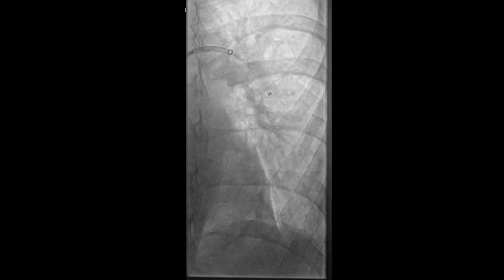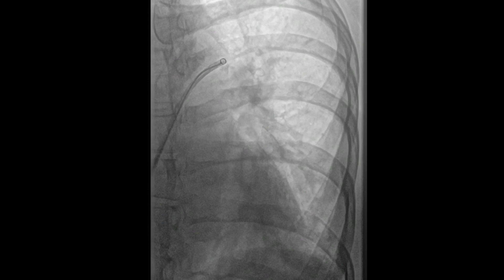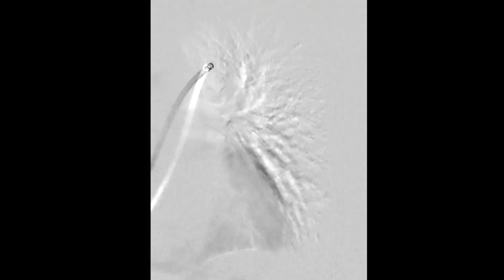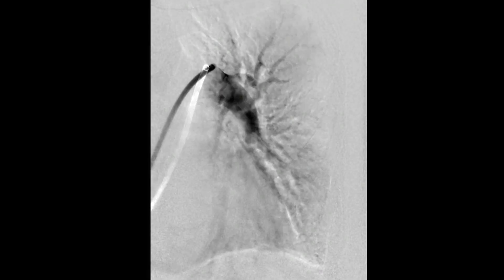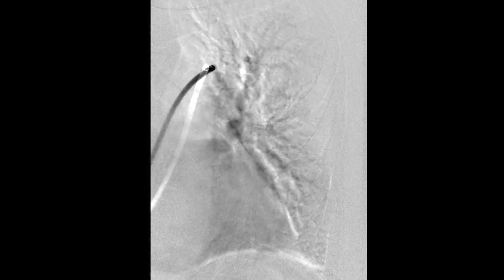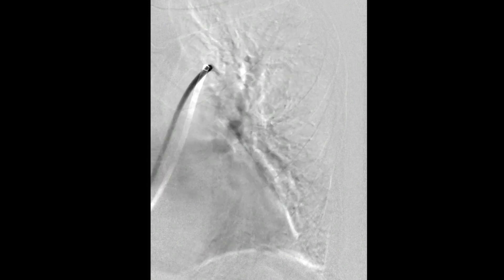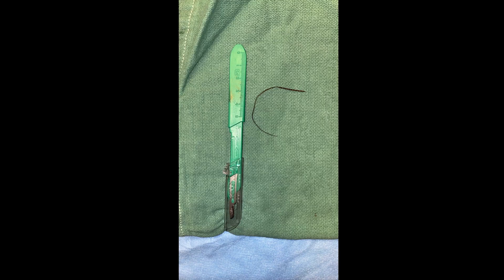Once the wire fragment was retrieved and externalized, repeat pulmonary angiogram showed filling of the main pulmonary artery and its distal branches without extravasation, confirming successful retrieval of the wire fragment. The wire fragment is seen here. This concludes our demonstration of the endovascular retrieval of a 7-centimeter wire fragment from the left lower segmental pulmonary artery.